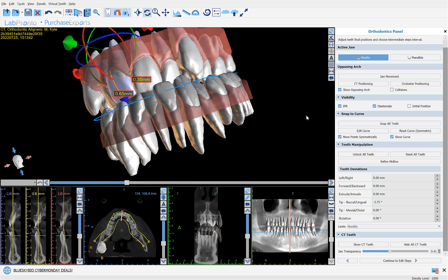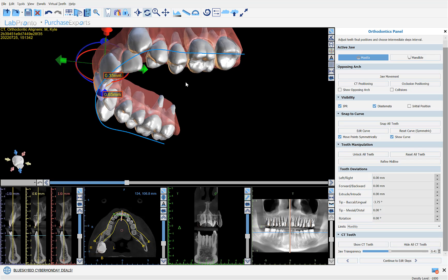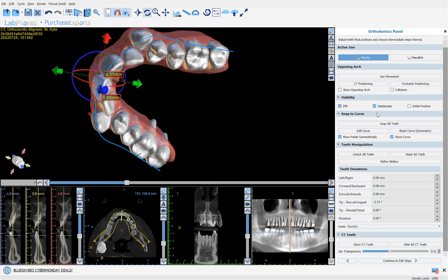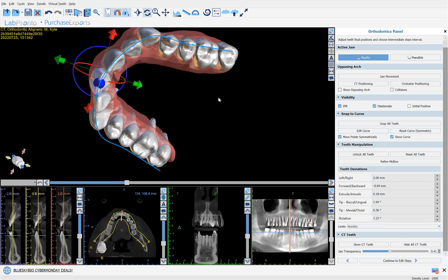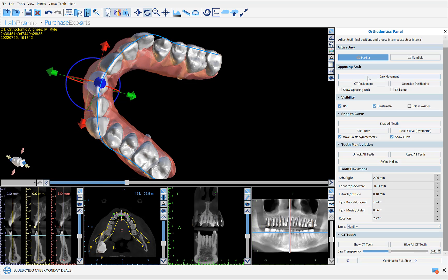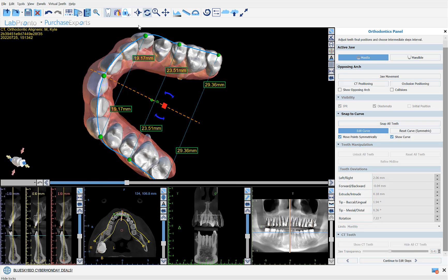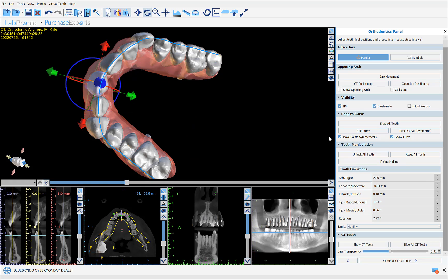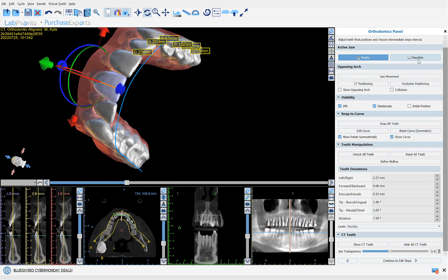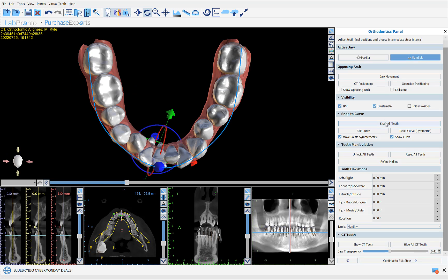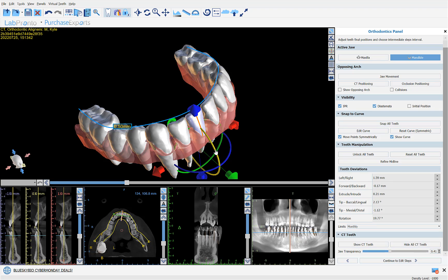For the purpose of this tutorial, I'm going to hide one arch and click snap all teeth to snap all teeth to the proposed curve. If we want to modify the positioning of the curve, simply click edit curve, modify the relevant positioning, and then click snap all teeth again. Let's proceed to the mandible and snap all teeth into position. We can modify the positioning of any individual tooth simply by grabbing and dragging the widget and adjusting the tooth accordingly.